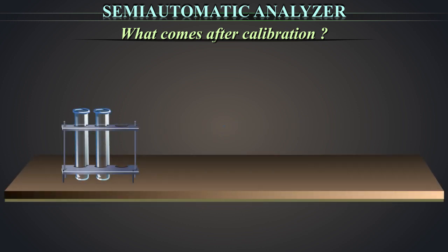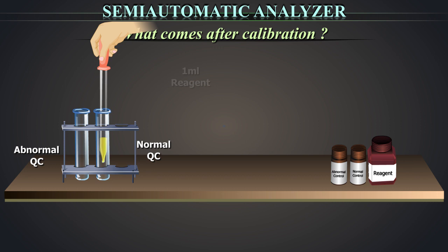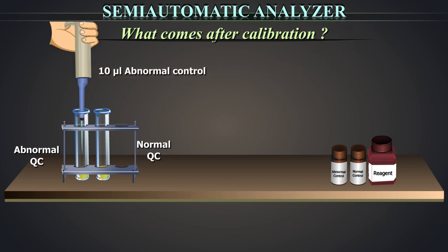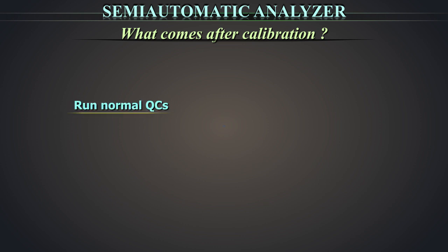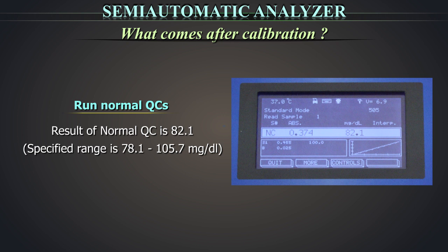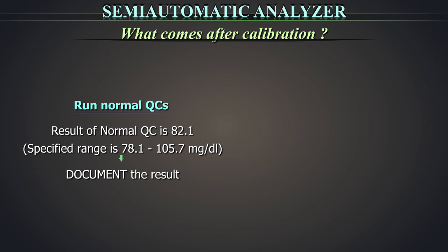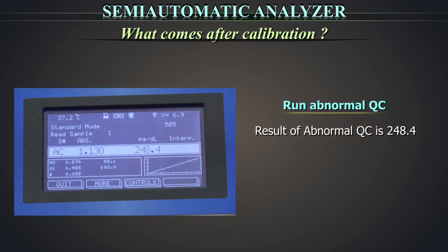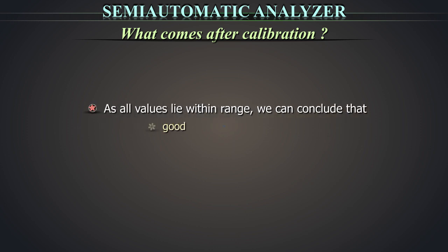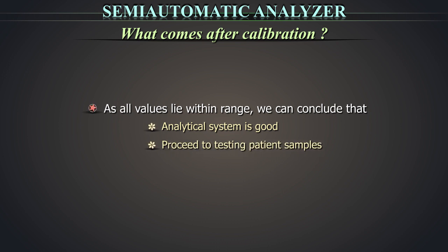Prepare the control tubes. Take two test tubes labelled as normal and abnormal QC. Add 1 ml of reagent to both, and 10 µl of normal control and 10 µl of abnormal control to the respective tubes. Run the QCs. The result of the normal QC is 82.1, which is within the specified range of 78.1 to 105.7 mg per deciliter. Document the result. Similarly, run the abnormal QC. The result of the abnormal QC is 248.4, which is within the specified range of 210 to 318 mg per deciliter. Document the result. As all values lie within the range, we can conclude that the analytical system is good and proceed to testing patient samples.